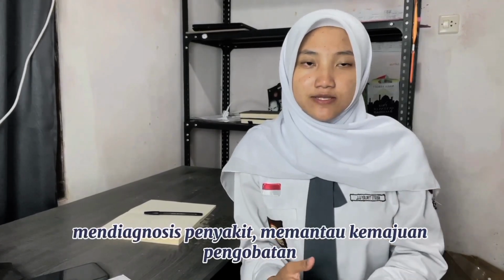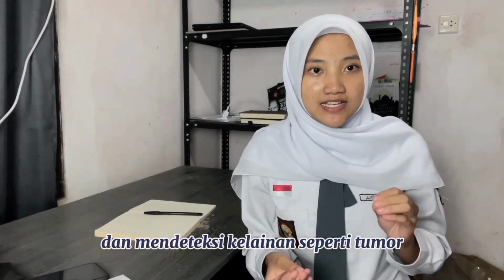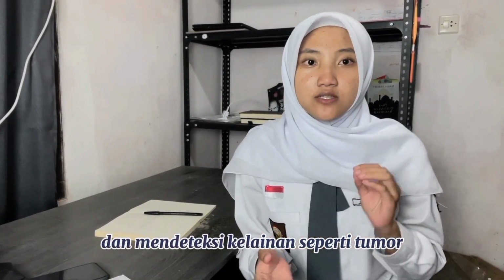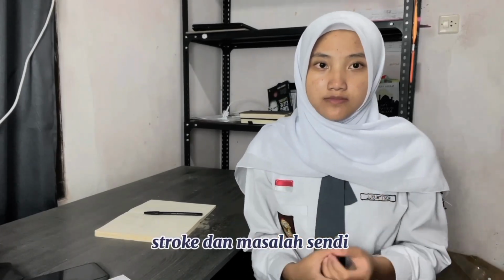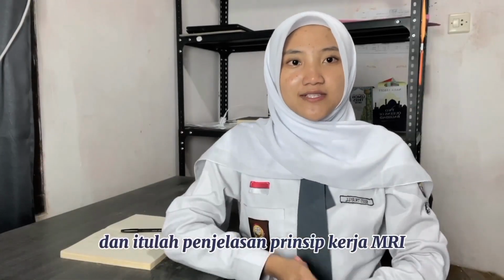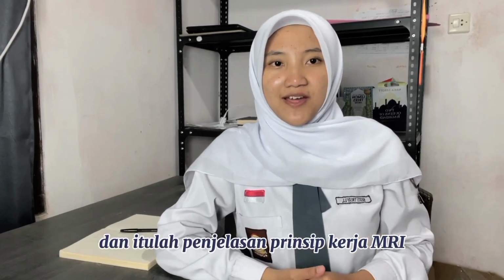And the purpose of an MRI scan is diagnosing disease, monitoring treatment progress, and detecting abnormalities such as tumors, nerve injuries, strokes, and joint problems. And that was an explanation of how MRI works.